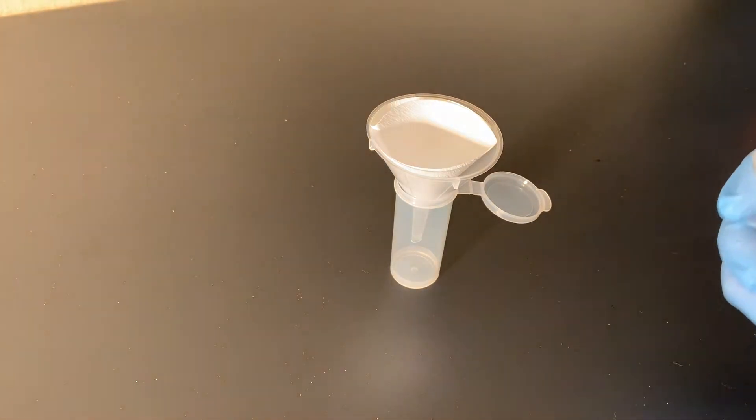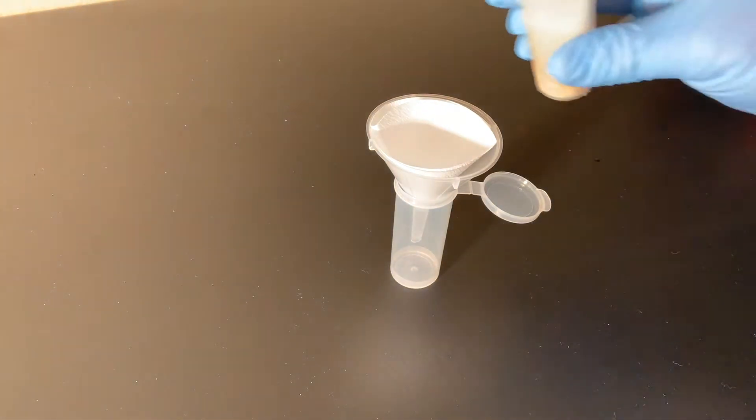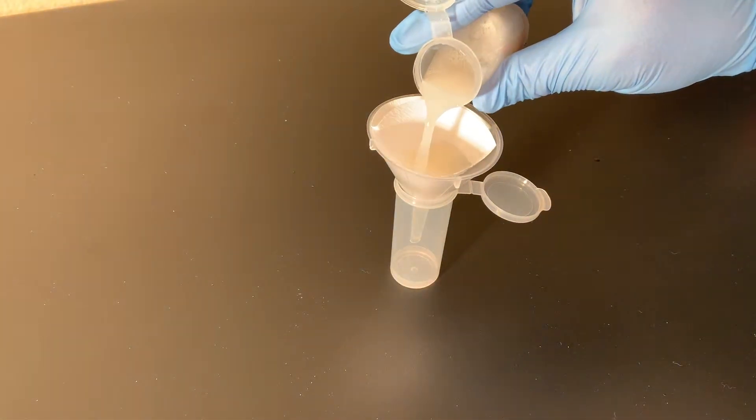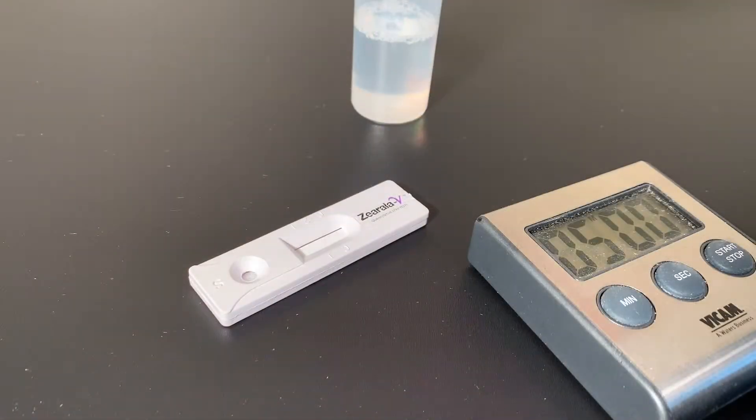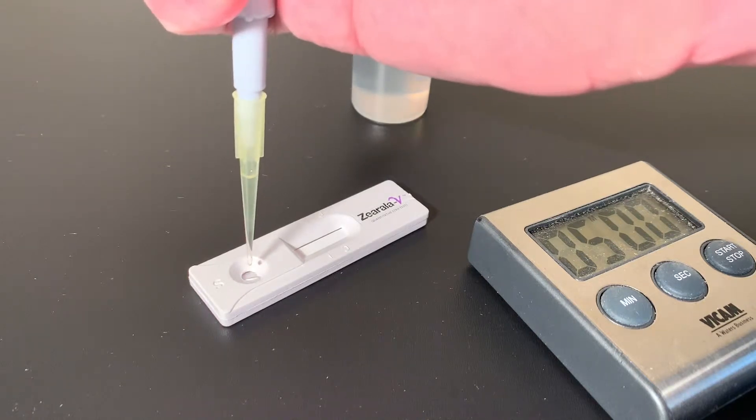Filter the extract into a clean tube. You can filter the extract up to 5 minutes. Pipette 100 microliters of extract to the sample well on the strip, one drop per second.